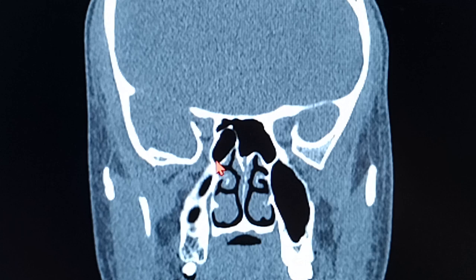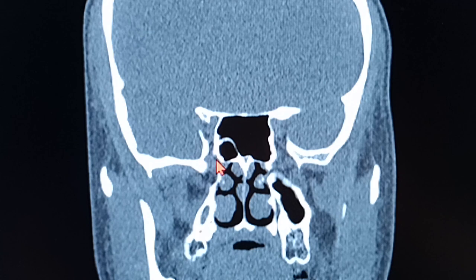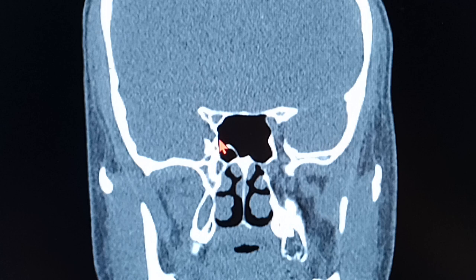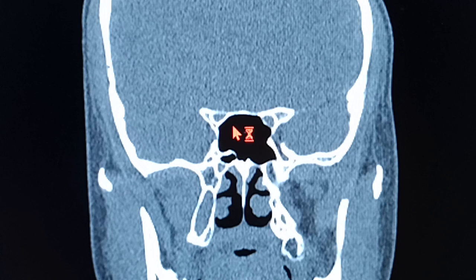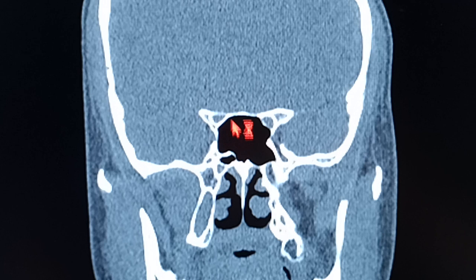So just for now, remember that this is the area of the orbital apex, inferior orbital fissure. This is the area somewhere of the ICA, which we go behind, could be the cavernous sinus over here. That's the anterior clinoid process. That's the optic nerve cupping, you can see over here. So we have the Delano classification for the optic nerve, or the 4 gradings of the optic nerve pneumatization in the sphenoid basically. So I'll talk about that. That's called the Delano classification, D-E-L-A-N-O, Delano.